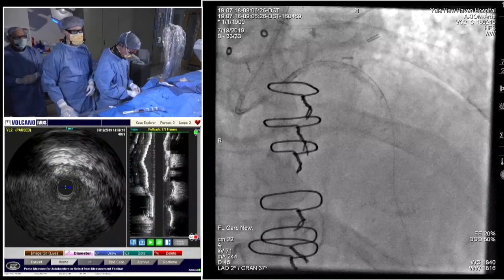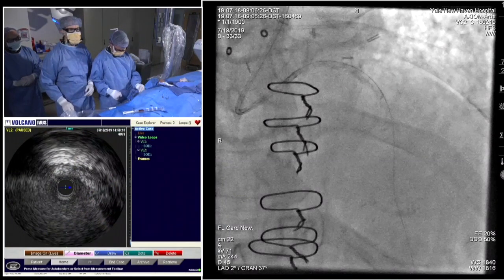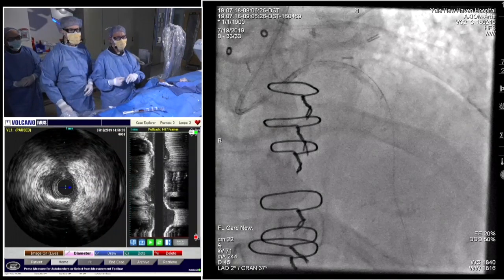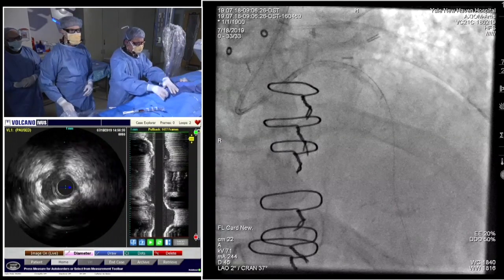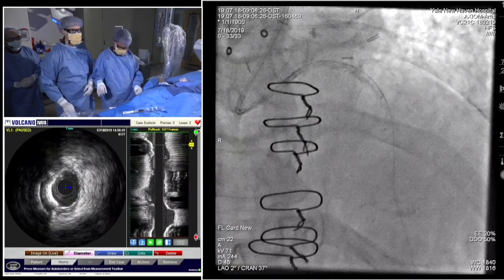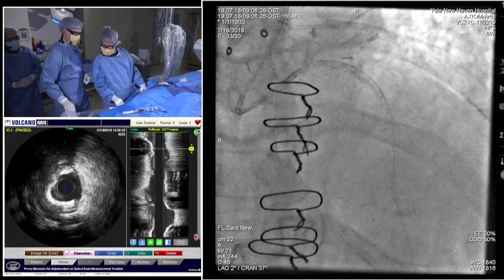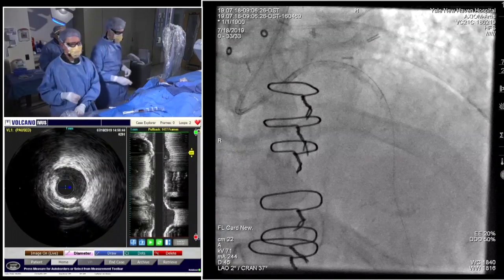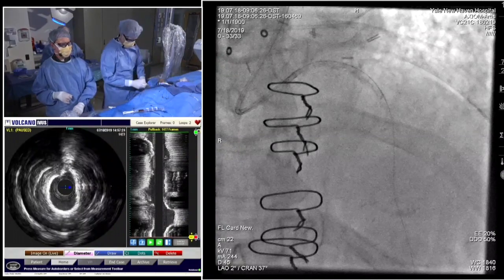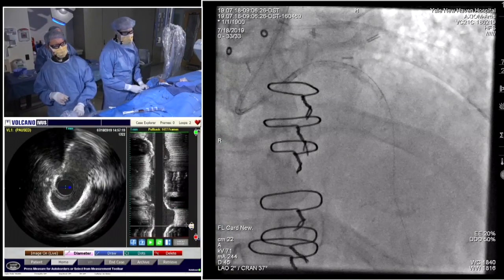Those pictures really nicely show what you're dealing with there. But I have heard people, especially colleagues I've graduated from fellowship with in recent years, say, well, I don't want to hurt this lady. She's very high risk and fragile, so I'm not going to do atherectomy because I'm afraid of the risk associated with that. But I think this is a good example that, in capable hands, her risk of perforation and exploding a bunch of balloons in her artery would go up by not doing that.